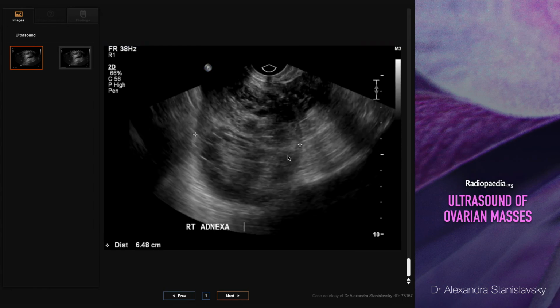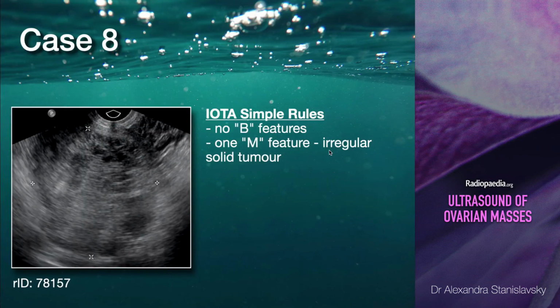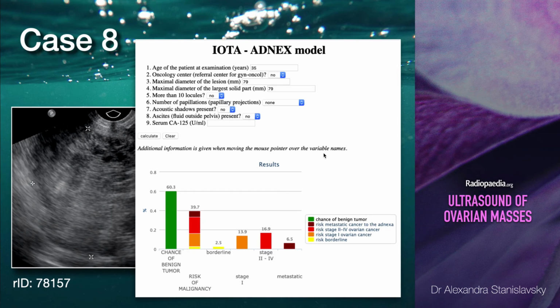We're certainly concerned. We think that this is likely to be malignant. IOTA simple rules, 1 M feature, irregular solid tumour. So IOTA agrees it's a malignant lesion.